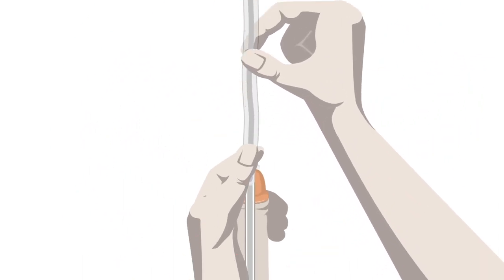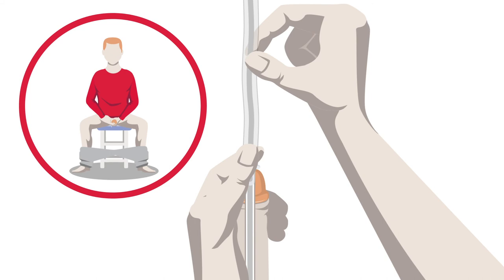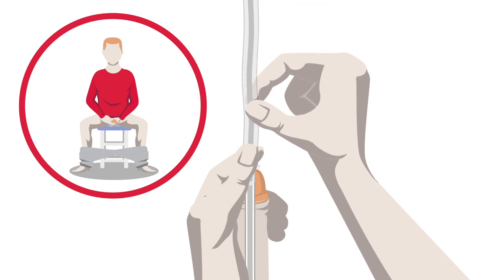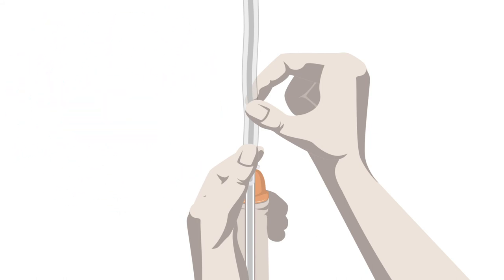At some point, you may think that you have hit a barrier, as it becomes difficult to insert the catheter further. If so, relax, take some deep breaths, or give a slight cough, and continue to gently insert the catheter. If you do not succeed after following these tips, stop the procedure, and contact your healthcare professional.